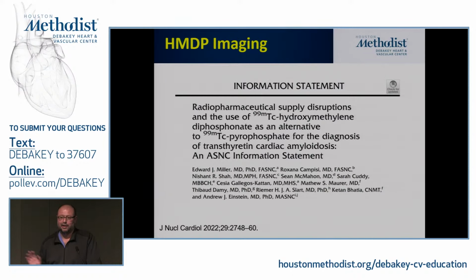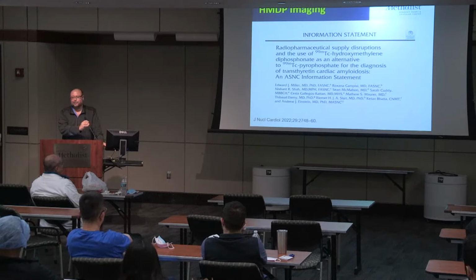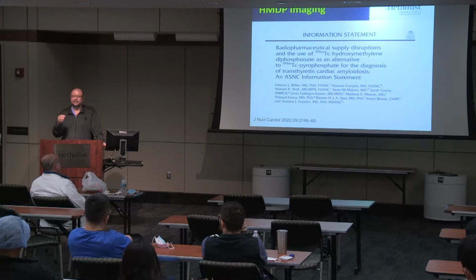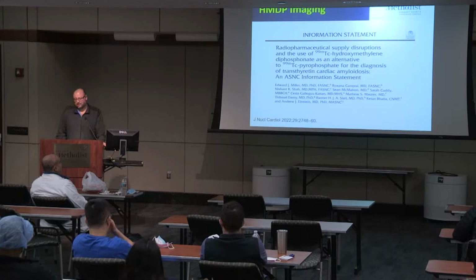No. In our lab, for the past 3 years, no more planar only. We told the lab we're doing only SPECT. But I'm talking for whoever is listening on YouTube or something, because in the community, the most common is still planar imaging, and without SPECT imaging, we've seen many cases where there were false callings or false positives.